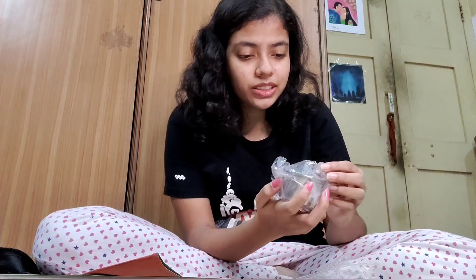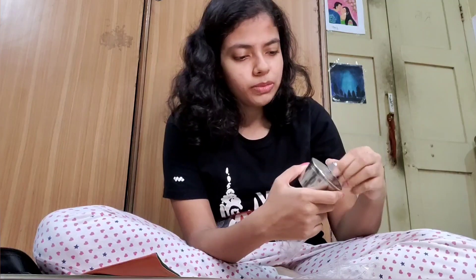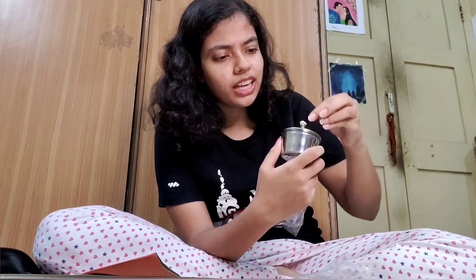This is the spirit torch or the spirit lamp. I think this is called a spirit torch or spirit lamp — something like that. Yeah, this has a wick.